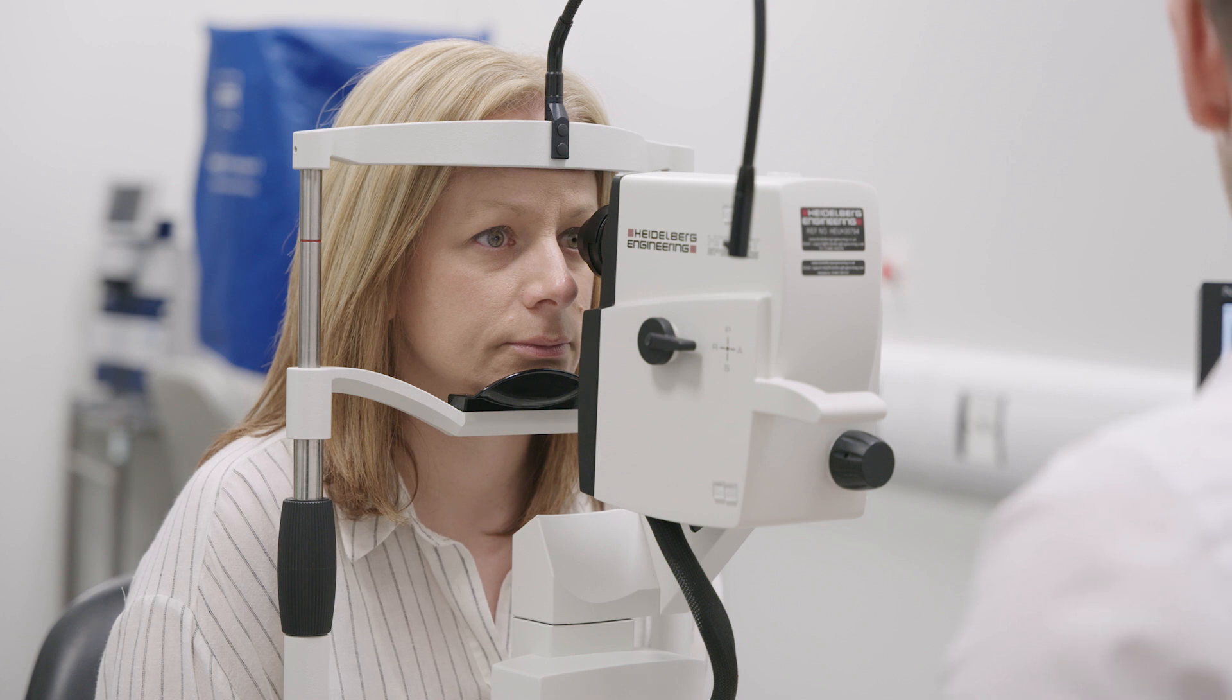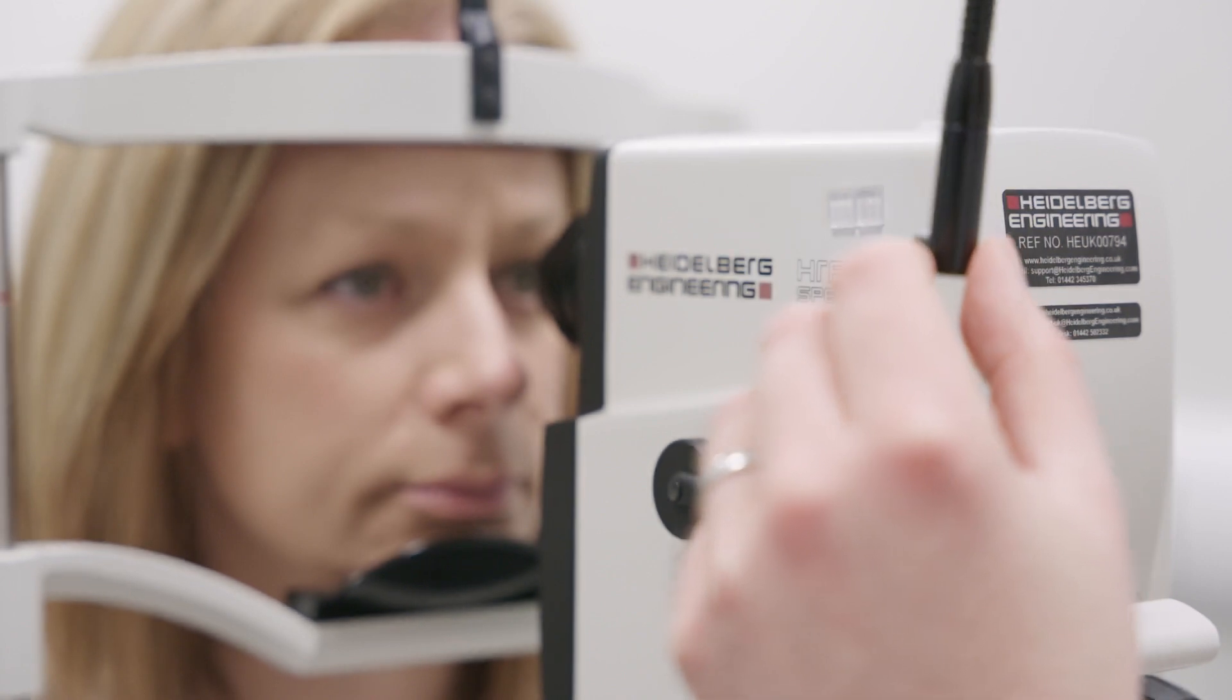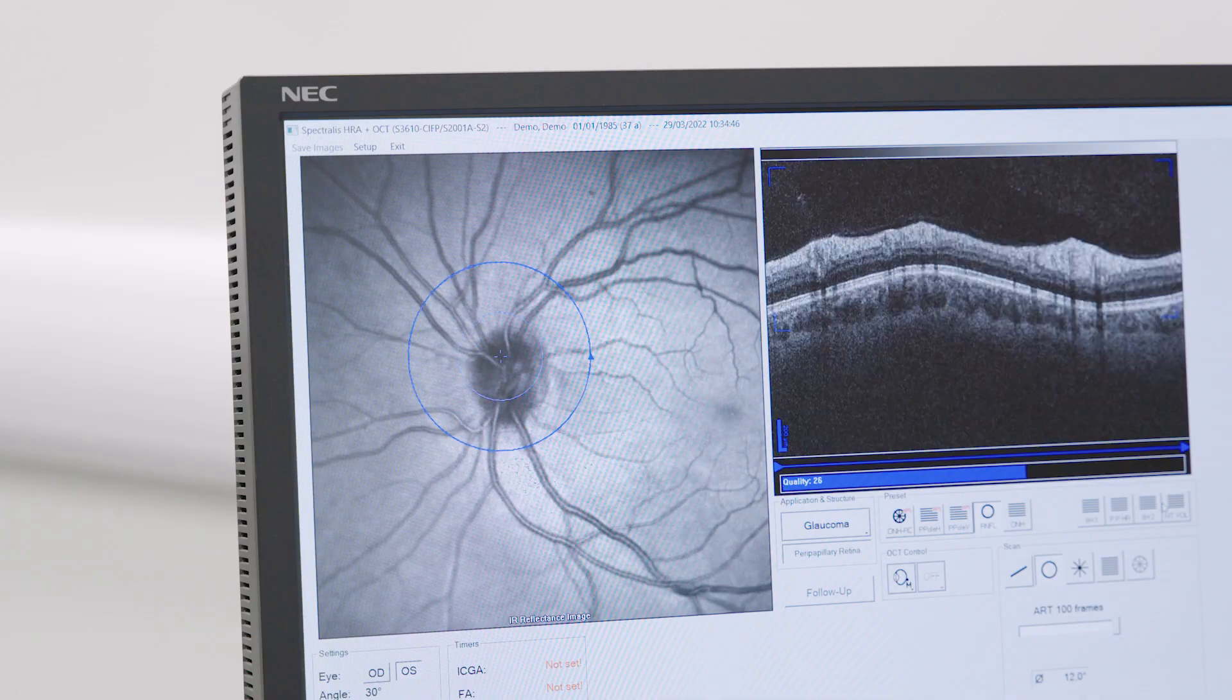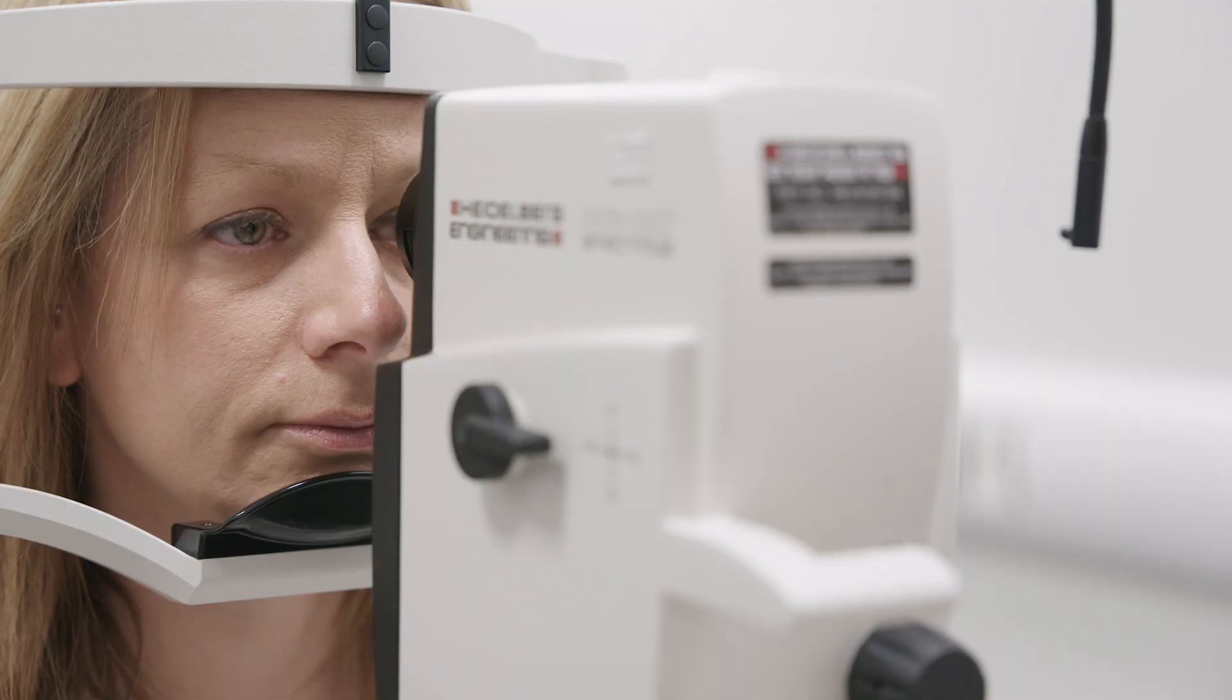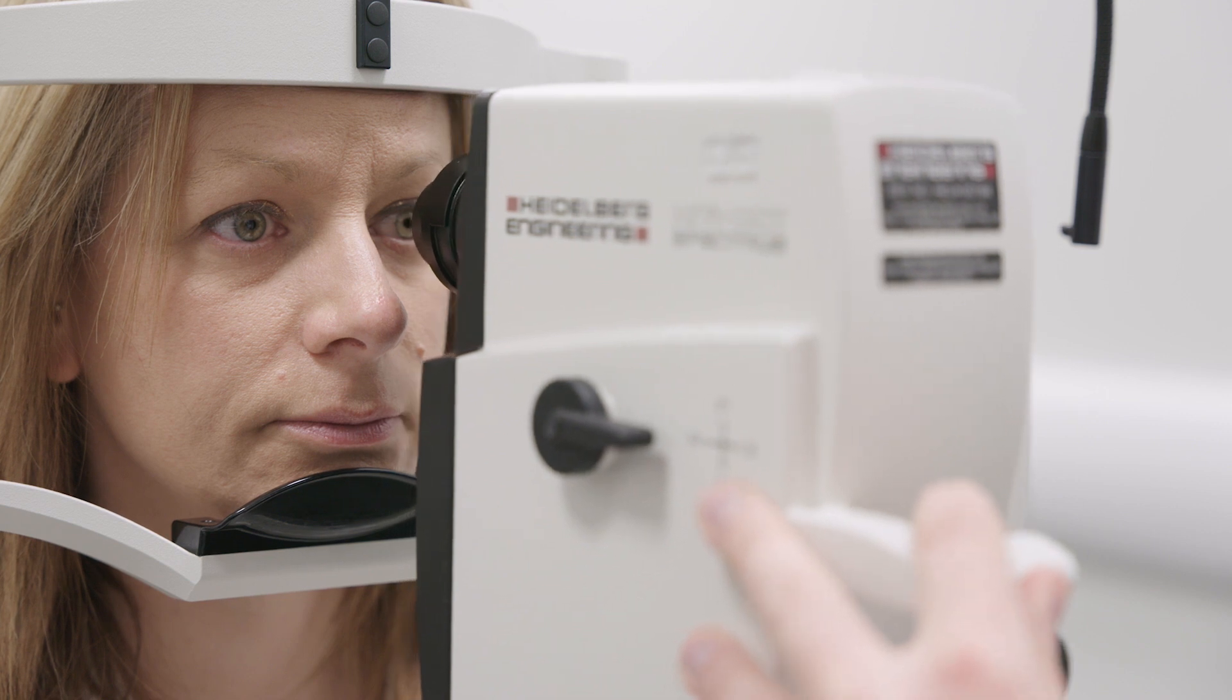If the patient is unable to fix with the eye being imaged, the external fixation target should be shown to the neighbouring eye and adjusted until the desired structure is clearly visible in the capture window. If the patient is unable to fix with either eye, encourage the patient to look straight ahead as best they are able.